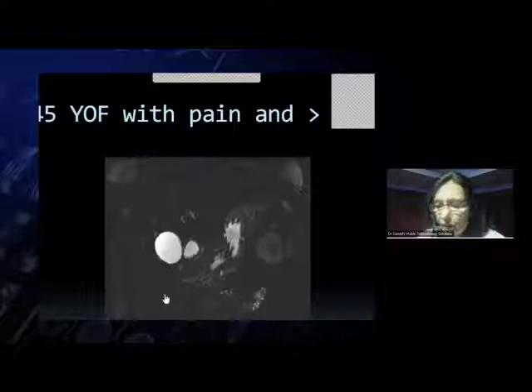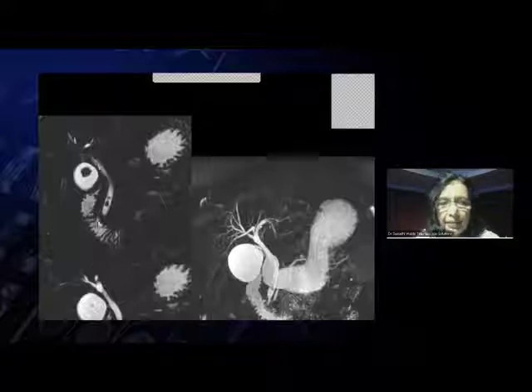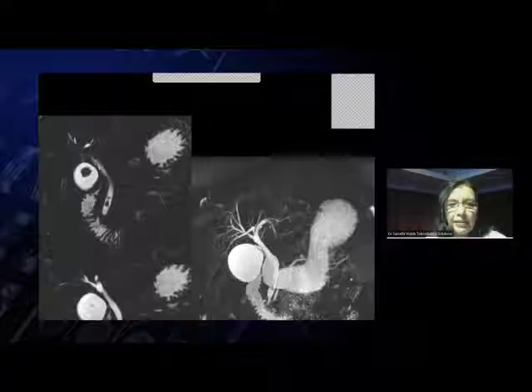I'll be sharing some body MRI cases with you, starting off with a straightforward case of an MRCP. This is a video clip of an MRCP of a patient who had gallstones going for a cholecystectomy. As you can see on the thin section coronal images and also the MIP images, there are filling defects in the distal common duct, confirming choledocholithiasis.